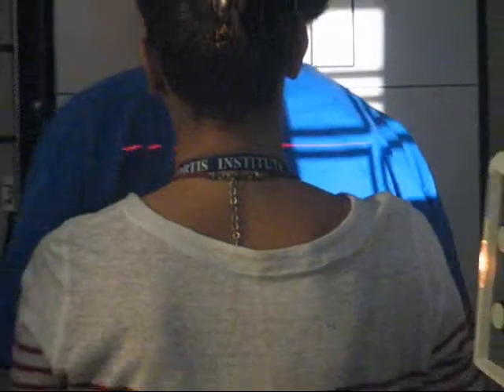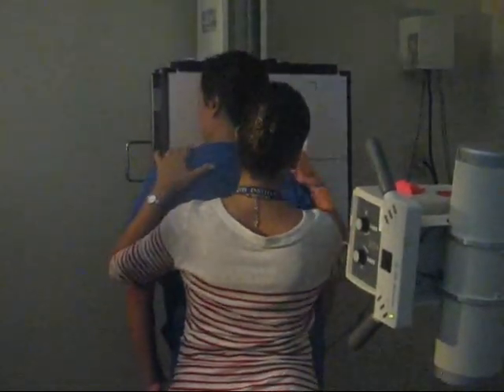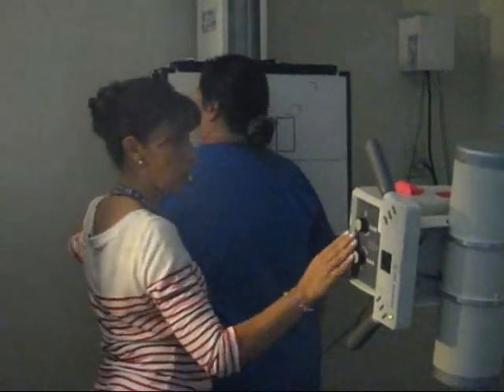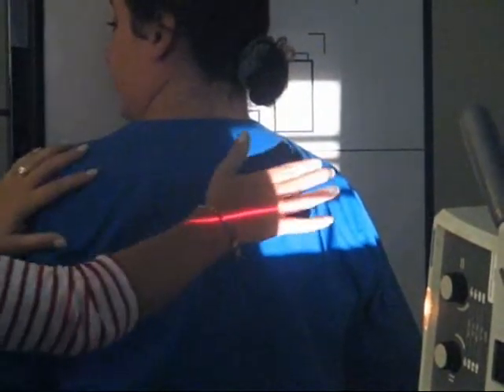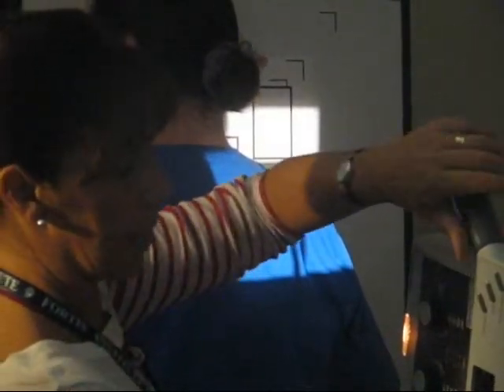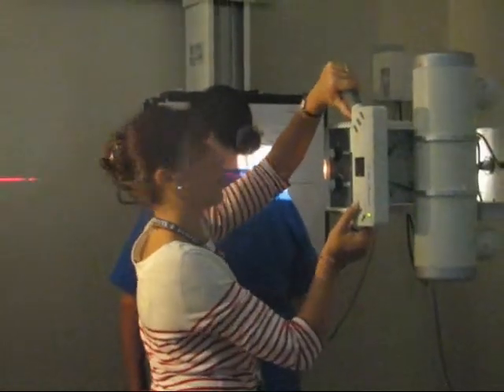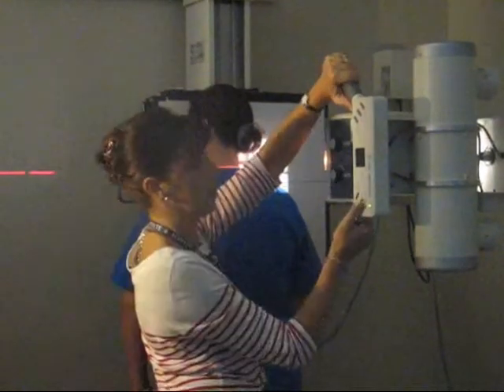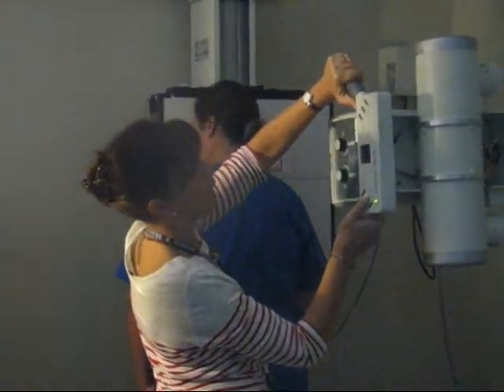You're going to stay straight now. Straighten out. Okay? Just try to bring it as close as possible. Of course, sometimes our patients are well developed, and it doesn't go as close as you want it to. But in this case, what you're going to do is angle 15 degrees caudad. Okay, so it's like you're picking at it from the top.